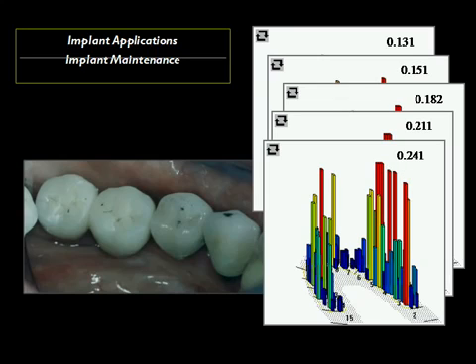So we're very specific in our timing, and I challenge anybody to tell me if there's an articulating paper out there that allows me to differentiate a 0.1 of a second difference between these contacts here and these contacts here.